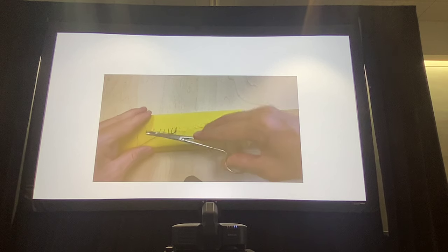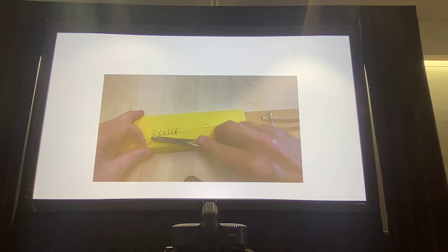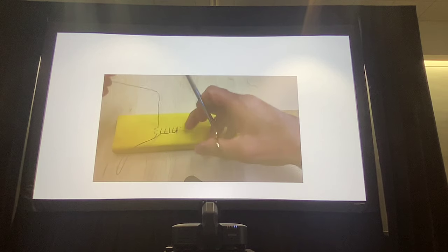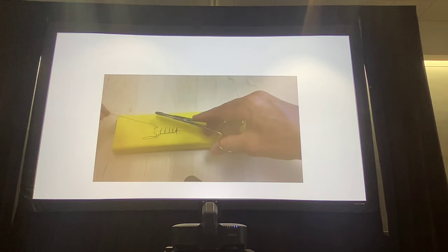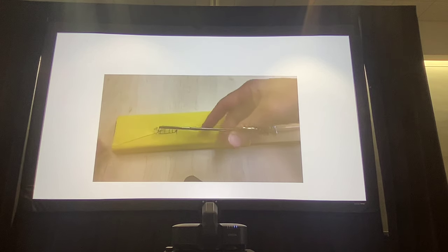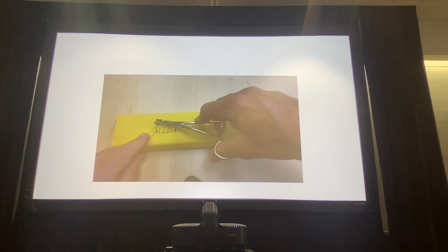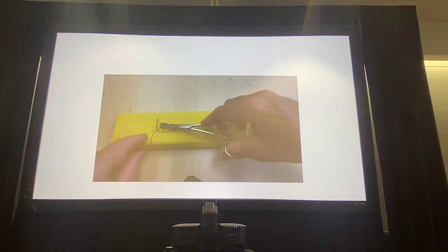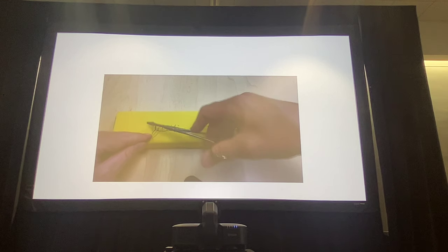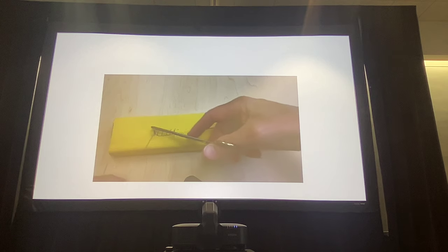Or if I'm going to use external sutures, maybe I should pick one that, like cruciate pattern, where I can span a larger distance with that pattern, and therefore have less suture material for my staff to remove. So just keep these things in mind. Be aware of how annoying it is at the recheck to do this. Most pets are amenable to it. You know, it's no problem. It just takes time, but keep that in mind. I will decide whether or not I want to do skin suture or not if the pet is fractious versus sweet, you know? Obviously, whatever is best for the healing comes first, but all things being equal, choose a pattern that's fair for your staff to remove at the recheck.